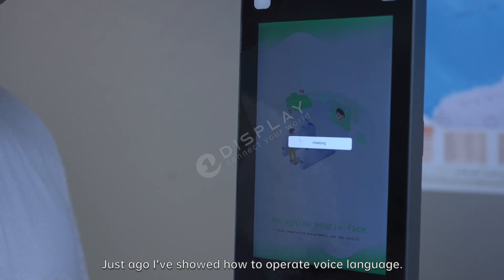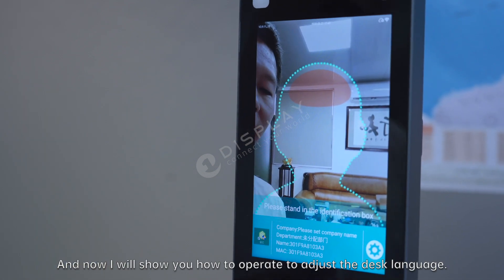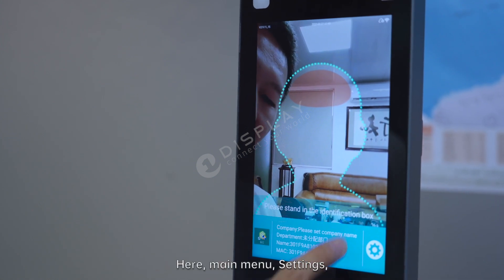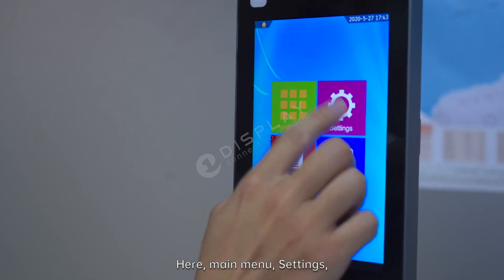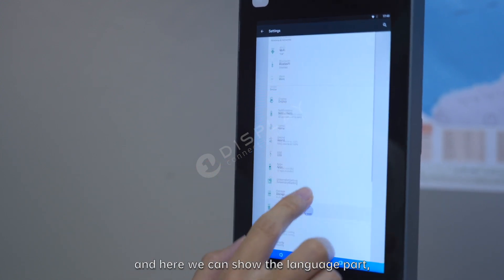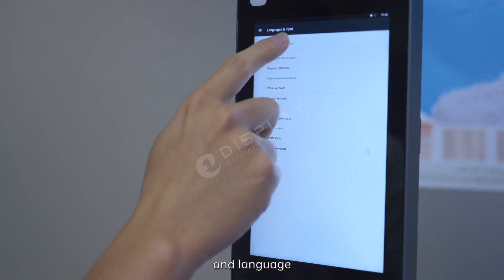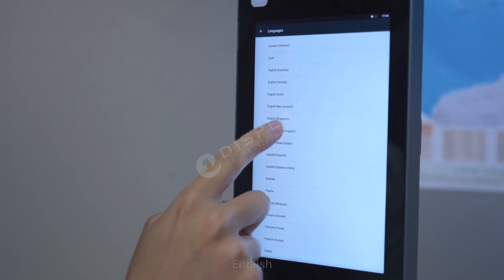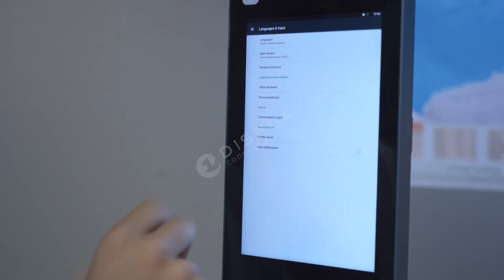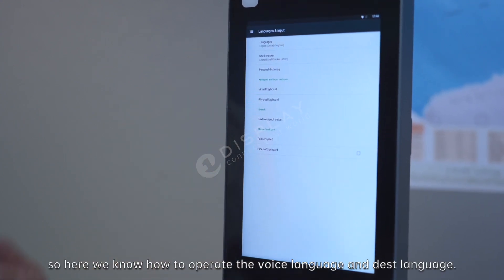I just showed you how to operate the voice language. And now I will show you how to operate and adjust the display language. Here in the main menu, go to settings, and here you can find the language section. The language is set to English. So now we know how to operate the voice language and the display language.